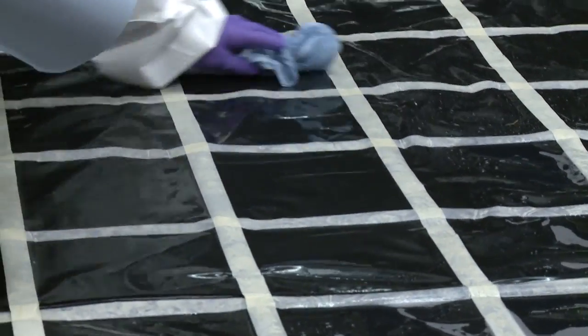You've just seen the test under UV lighting. We've now switched the standard lights back on. I'm going to try and clean up from the cleanest areas to the dirtiest areas to avoid contaminating myself.